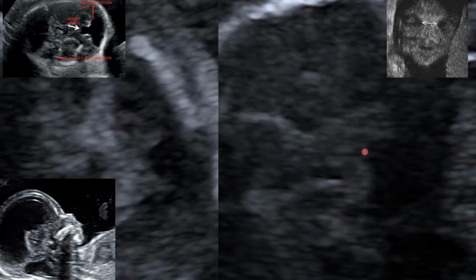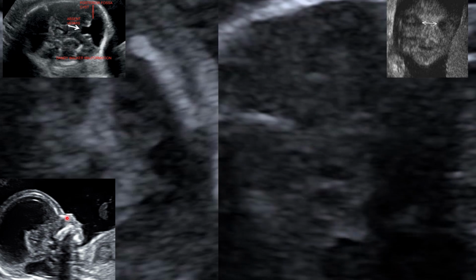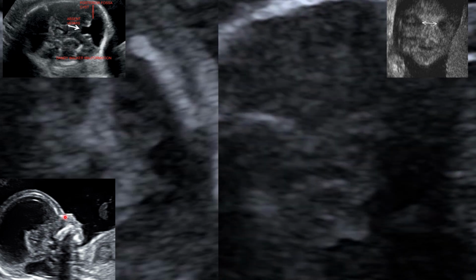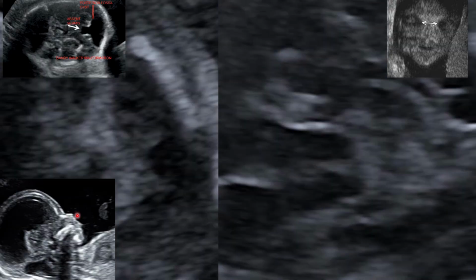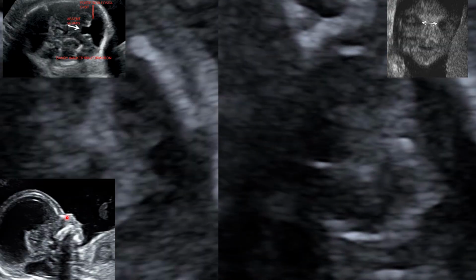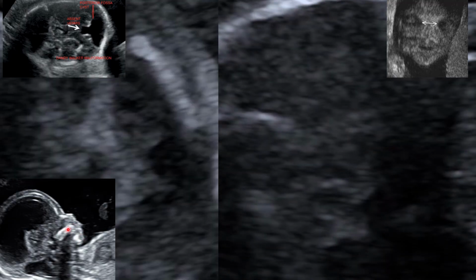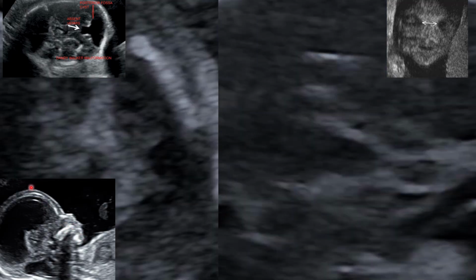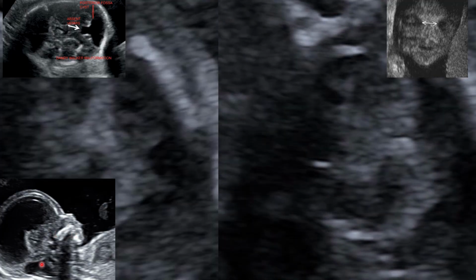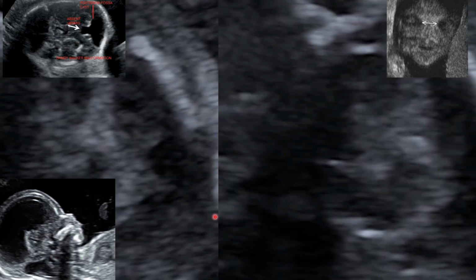So in the same view, you can see that the nasal bone of the baby is there also. This is the second trimester, but normally the screening of the nasal bone we do in the first trimester. It's also good to keep on checking and confirming that the nasal bone is there. And you can see the chin is also there. This is the palate bone. So they are present. That's the profile view. That is very important in assessing the fluid at the back of the neck.